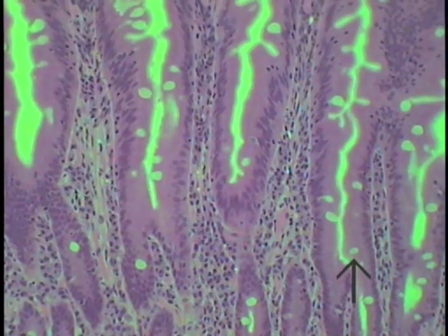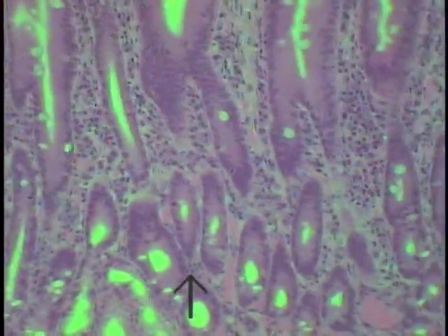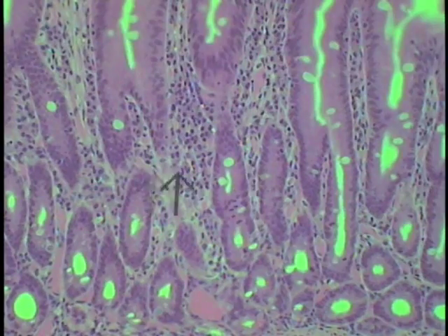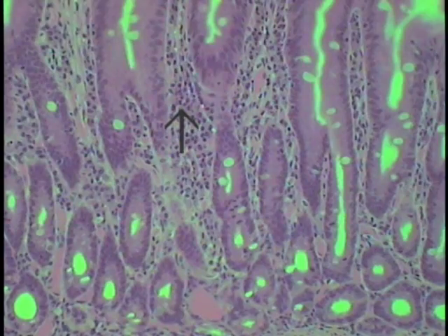Now note that the lamina propria fills the core of the villi and then surrounds those intestinal glands and completely envelops them. All of this material here is that lamina propria. And closer examination will show that this particular lamina propria is part of the GALT, the gut-associated lymphatic tissue. And all of these cells, if examined at higher power, would be of the lymphoid series: lymphocytes, differentiating plasma cells; you'd see eosinophils and leukocytes.